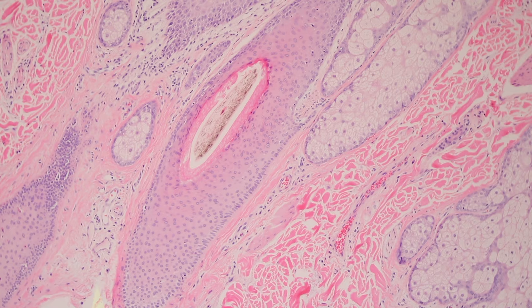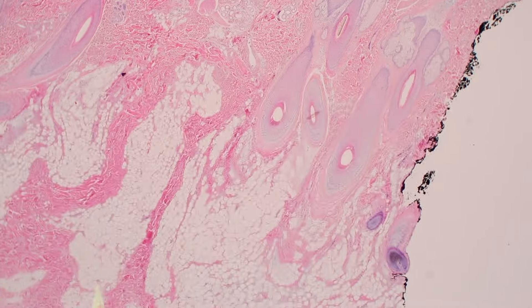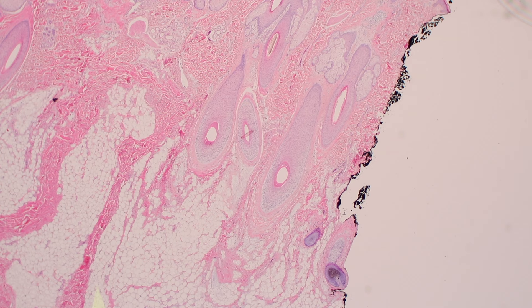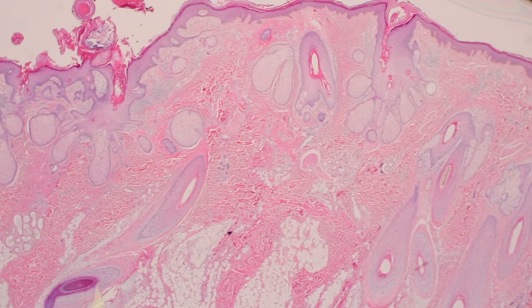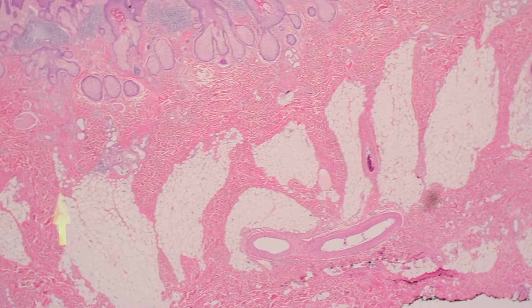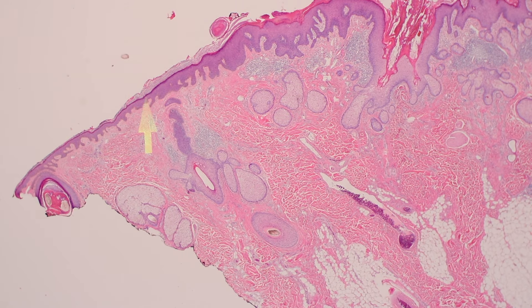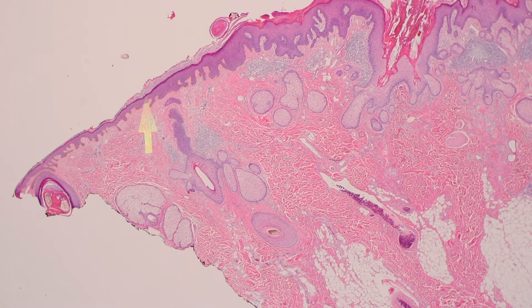Normally the scalp has tons of hair follicles with big thick roots down in the subcutaneous fat. But then suddenly there's one last curving hair follicle and they're gone. In the nevus sebaceous area, you have dermis and subcutis with sebaceous glands but no follicles. As you get back to the other edge of the lesion, the nevus sebaceous ends and the hair follicles come back. This is why these lesions are alopecic — they lack hair clinically and look like a little bald patch on the head of a baby.